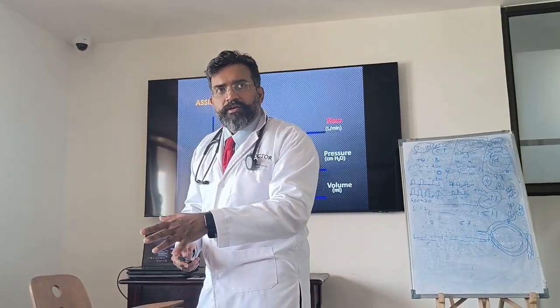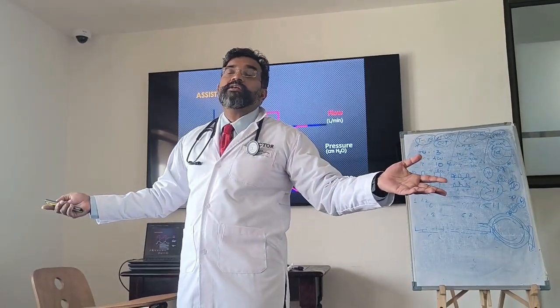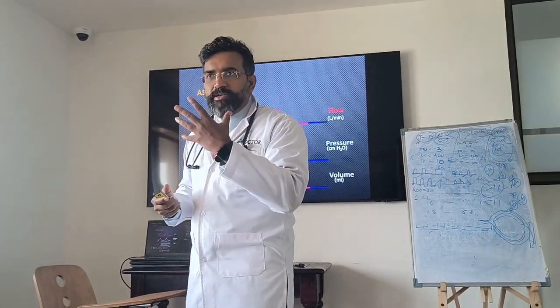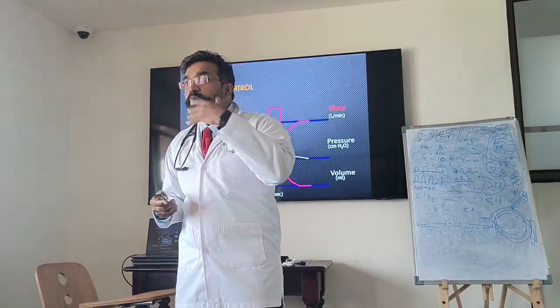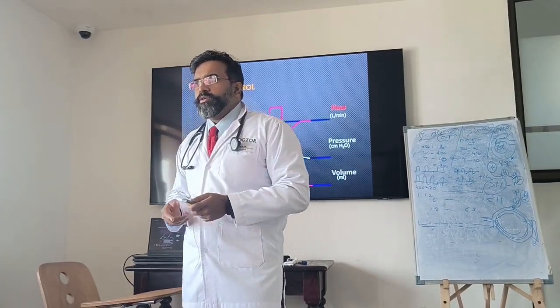Are you understanding? Just because the patient is not showing any signs, that doesn't mean the ventilator is not giving you information. वो वेंटिलेटर बता रहा है तेरे को भाई, there is something wrong with this patient, he is breathing very fast. You have to figure out what is wrong. समझ में आ रहा है?